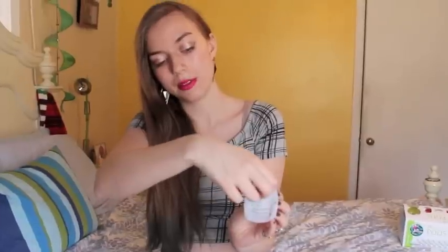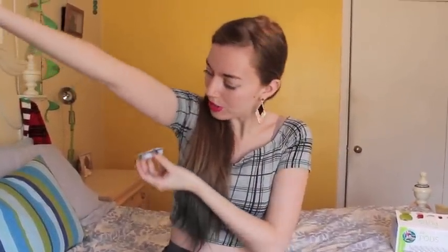Next, you're going to get these little tabs, pull this one down, and pull this one up, and you've got a nice sticky surface to stick to your skin. So like I said, we're going to put it right here. I usually face it this way. You can face it this way, pretty much face it whatever way you want, but this is the way that I'm used to doing it.